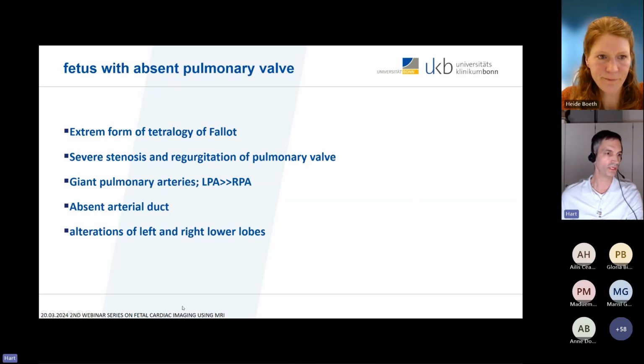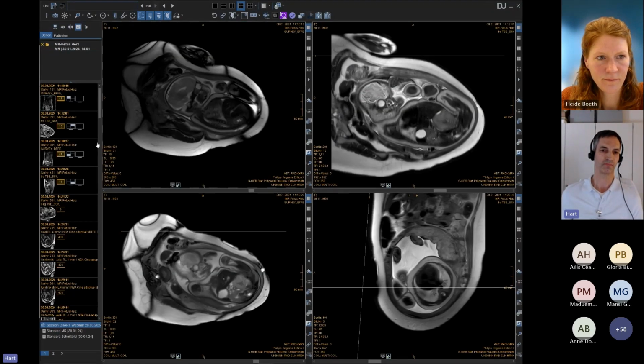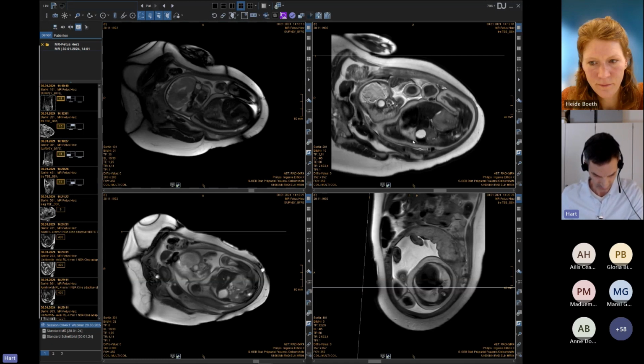So I will show you some images. As I mentioned, we start with the first survey and with the first SSFPs to get an idea where the heart is and where we can place the ultrasound transducer. The first single shots, the first black bloods that we used, are aligned to the mother. You can see this is the belly button, so we have an orientation to place the transducer on the mother's belly. And afterwards, this is the second survey.